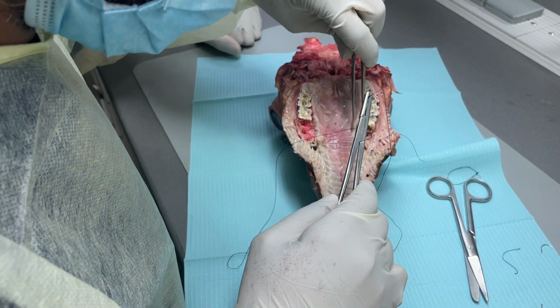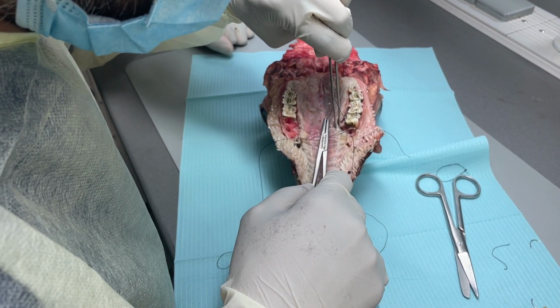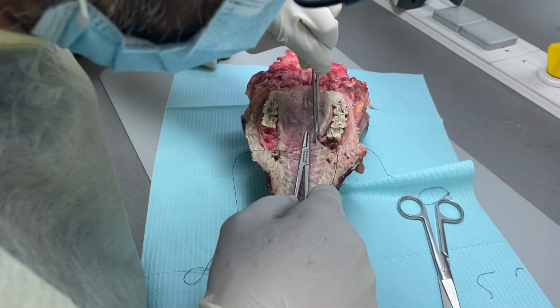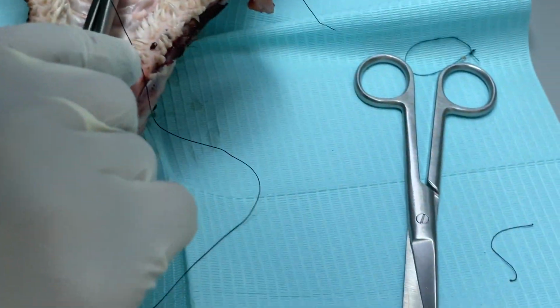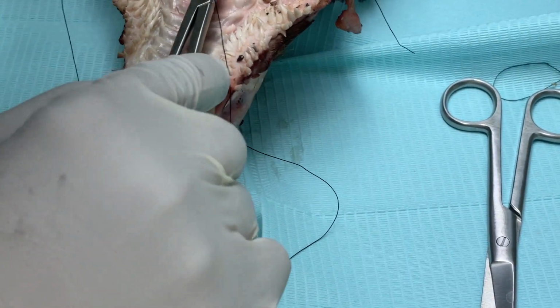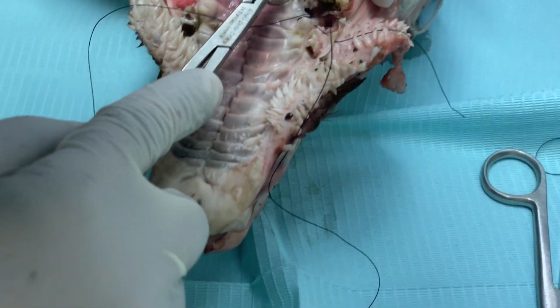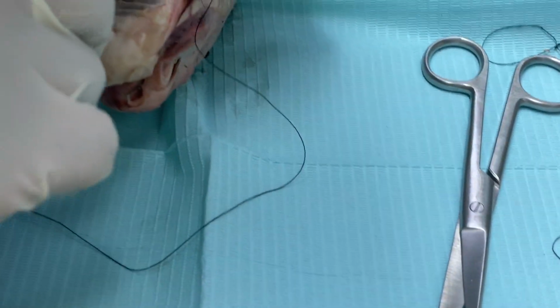Outside to inside. External to internal. You can take internal to external also, no problem, but it is easier this way. Oh, it's very thick. It's very thick, no problem. Wait, I'll just push it a little bit. Okay, got it.